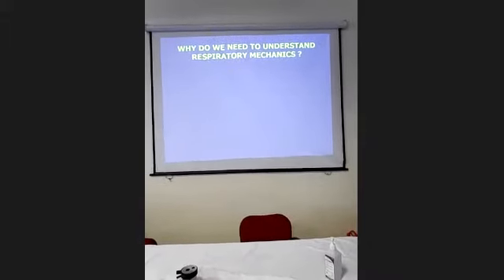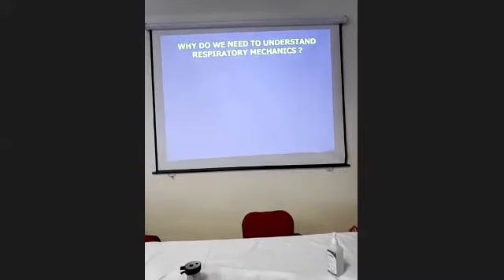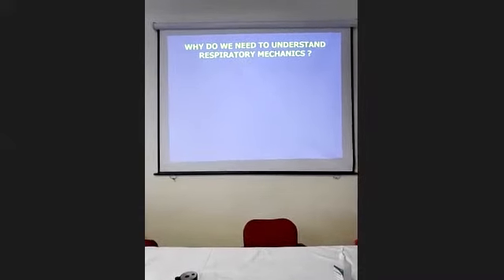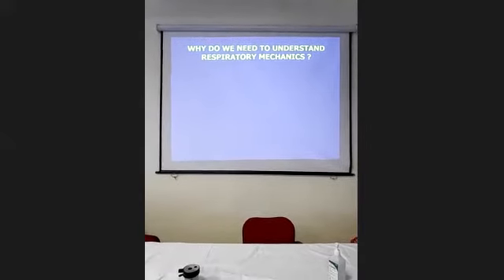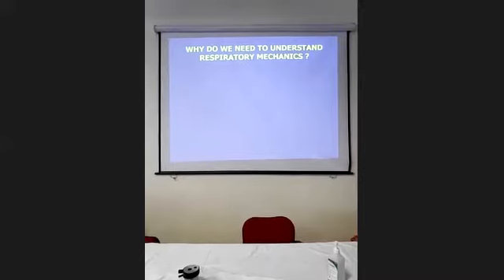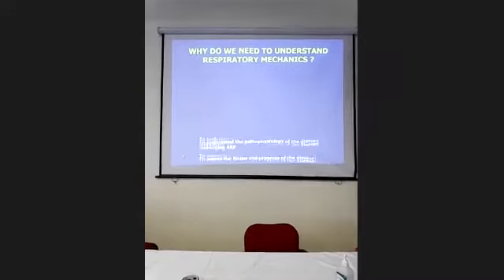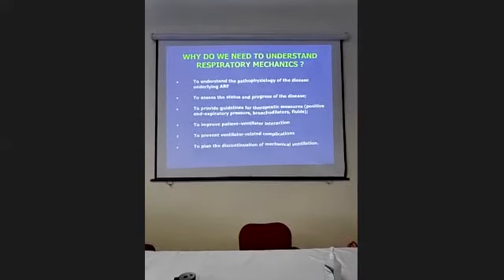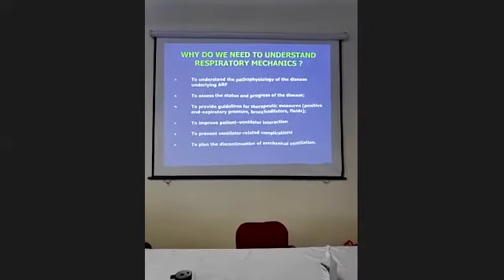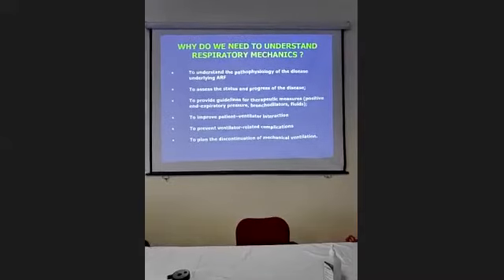Okay. Then why do we need to understand respiratory mechanics? Because unless you understand the respiratory mechanics, it will be very difficult for you to do the ventilator setting, because it will be reflected in a graphical manner on the ventilator. And unless you understand the mechanics, it will be very difficult for you to set the ventilator properly for the right patient. So, to understand the pathophysiology of the disease underlying acute respiratory failure, it may be a COPD patient. They require a different kind of ventilation. Bronchial asthma, they require a different kind of mechanics.